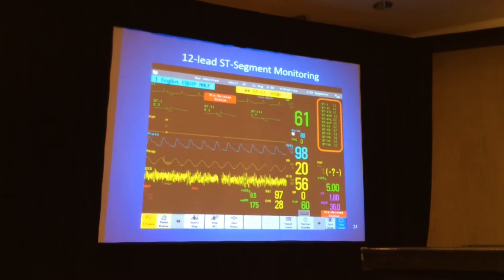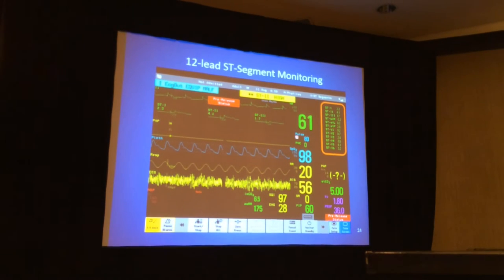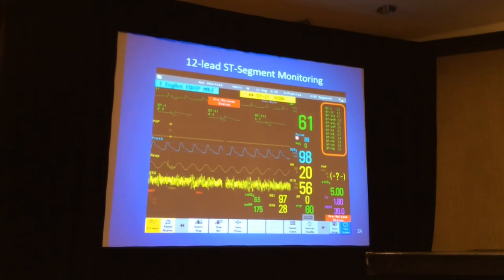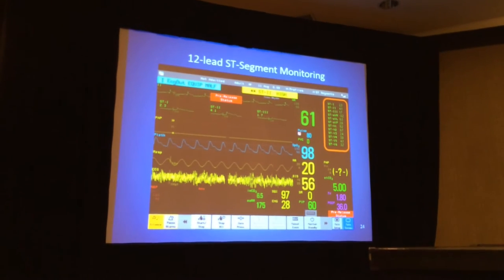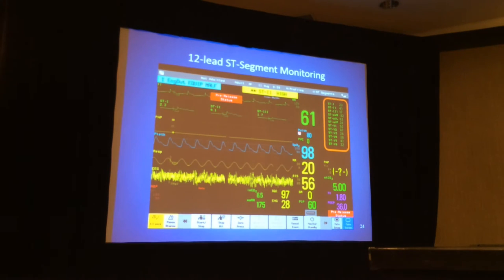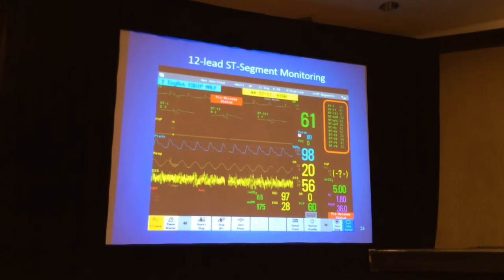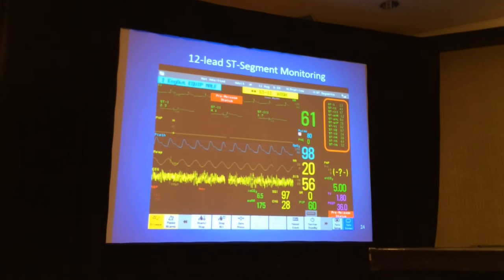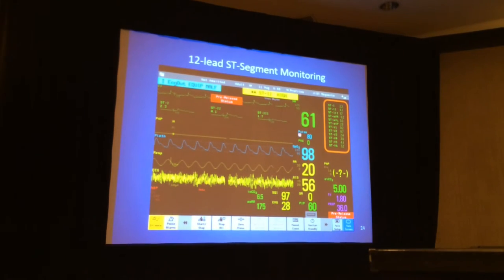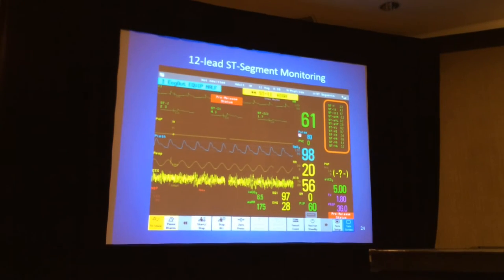Now, this is an illustration that John Wang provided me from Philips. It is obviously a busy-looking display, a bedside monitor display that Philips uses that has many things on it, and I won't go into all the different parameters. But you can see here there's 12-lead ECG monitoring. There are various ECG leads with ST elevation, and out here there's a listing of the amount of ST segment deviation in each lead.